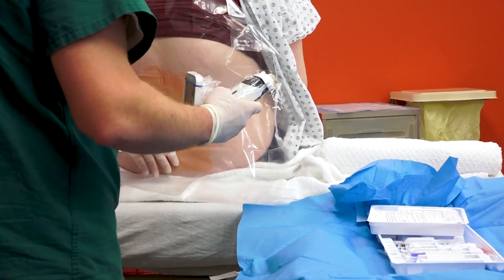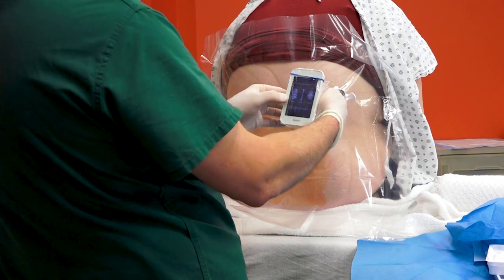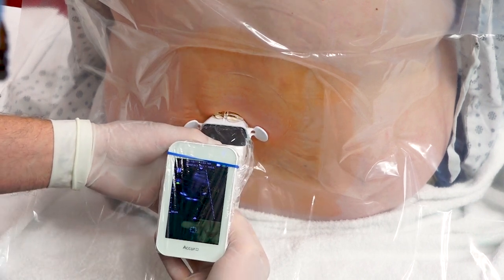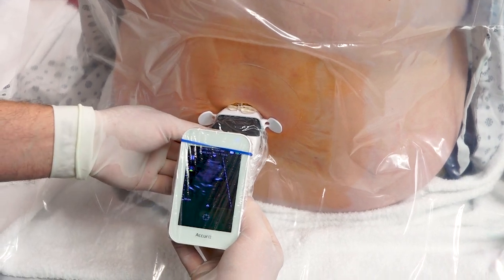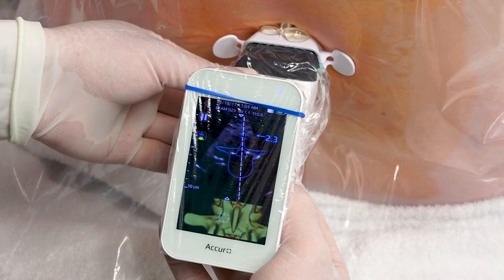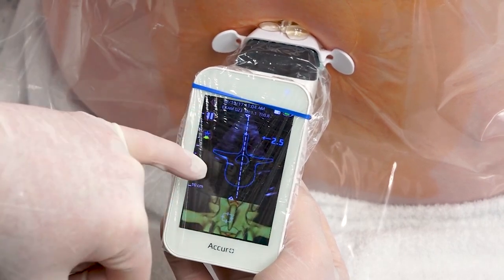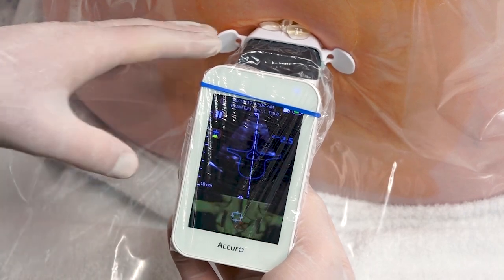Let's go back to that position we discussed before. Turn on again the ultrasound by hitting the spine button and we start. We can see this white line is telling us that we are off-center. You want to bring that line up to the midline, where we can already see the spinous process, as shown by this dot here, and you can see it represented in the 3D image.